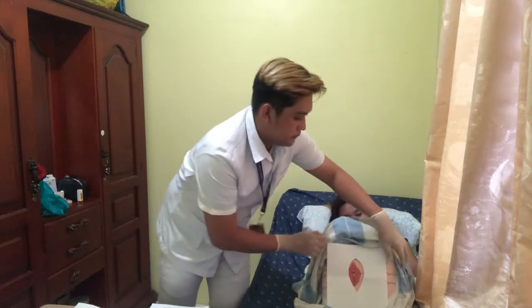Okay, so now we'll lubricate the catheter for about 1.5 inches to reduce friction. While doing this, we should be careful not to plug the eye of the catheter.